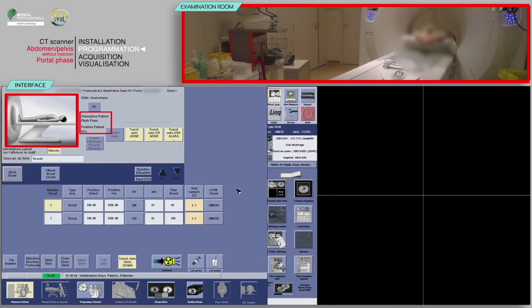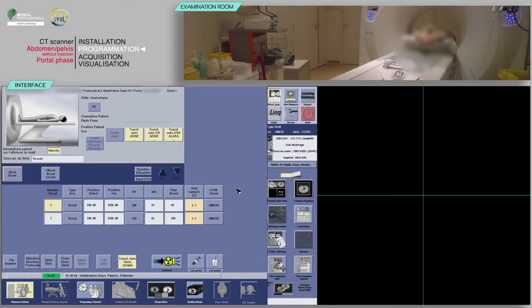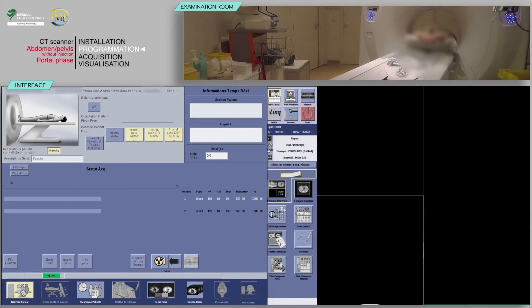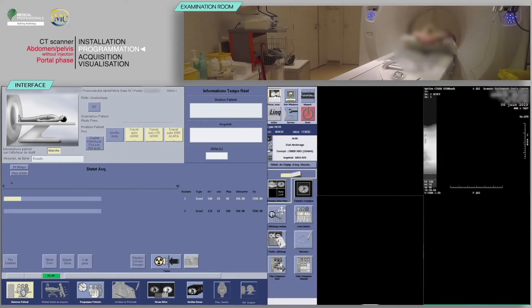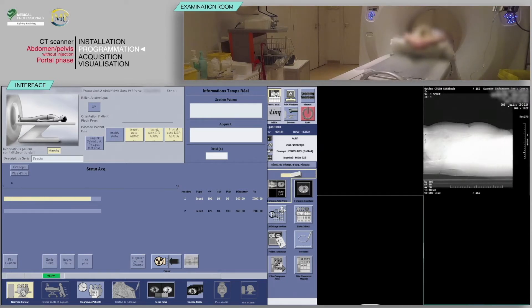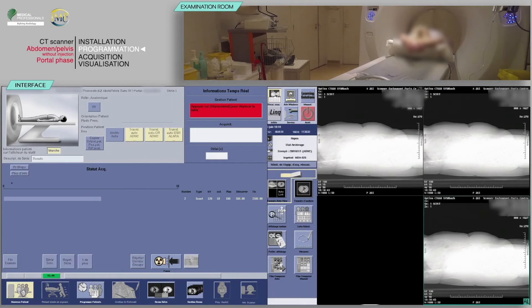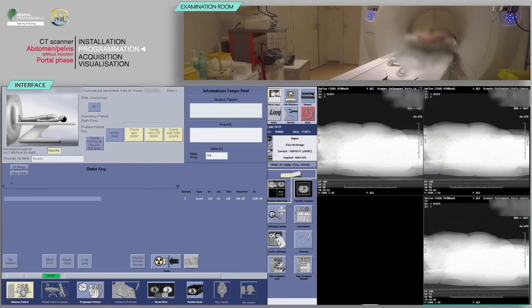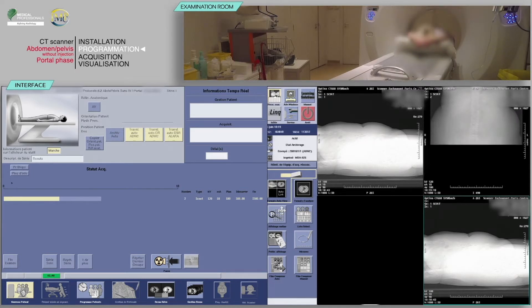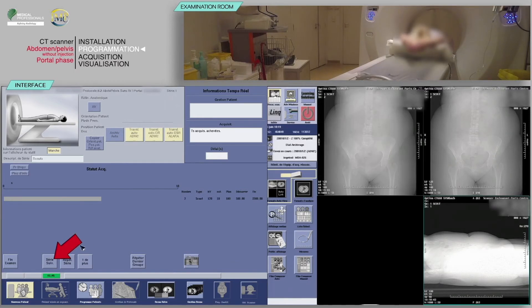Note that the patient's orientation is feet first. After verifying the scan parameters, click Confirm. On the keyboard, move the table and launch the acquisition when the buttons flash. Click on the next series.